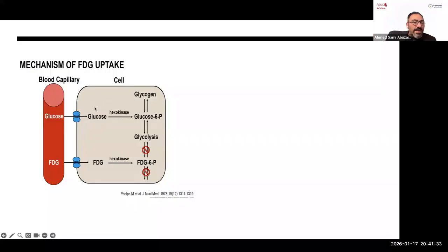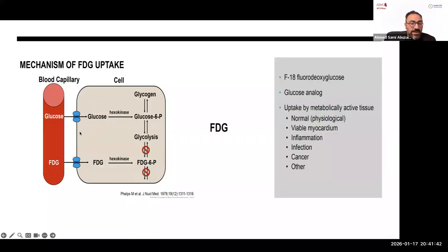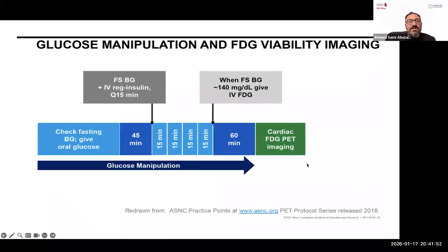Usually the myocardium going to uptake the glucose and the metabolism, right? Depending on your uptake in the receptors. And we learned that FDG can act as a glucose with the same enzyme, and we try to make this uptake happen in the myocardium. And when we see that, we can get a lot of information. But really, in coronary artery disease, you really have to delineate between a few disease processes, as we're going to see.